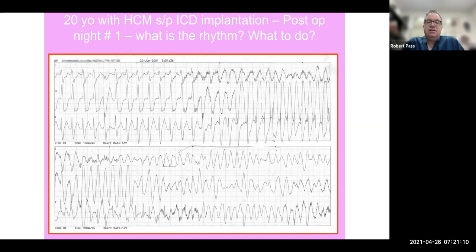or you could put in a so-called dedicated rate sensing lead. In other words, you could take a pacemaker lead, just a plain regular pacing lead that you would use for a pacemaker that has a true bipole at the end, put that into the ventricle next to this lead and use that as the sensing lead, and use the defibrillator lead that doesn't sense as well, but still seems to shock well, as the shocking lead.